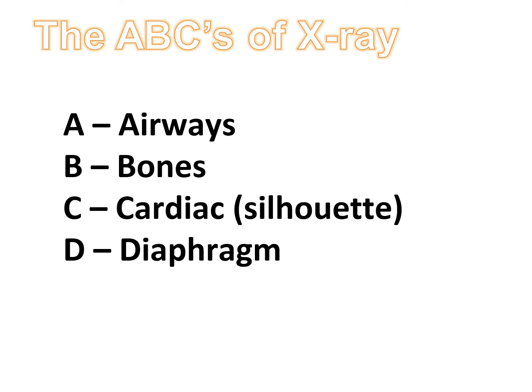Also, you're looking at the diaphragm. The right diaphragm sits slightly higher than the left due to the liver, and then your diaphragm is going to lose its concave appearance and appear more flattened in COPD patients.